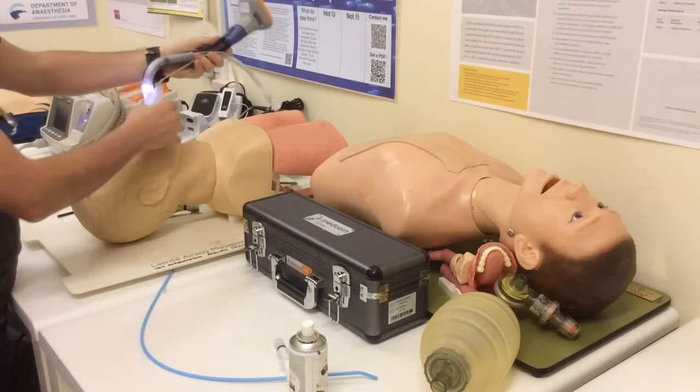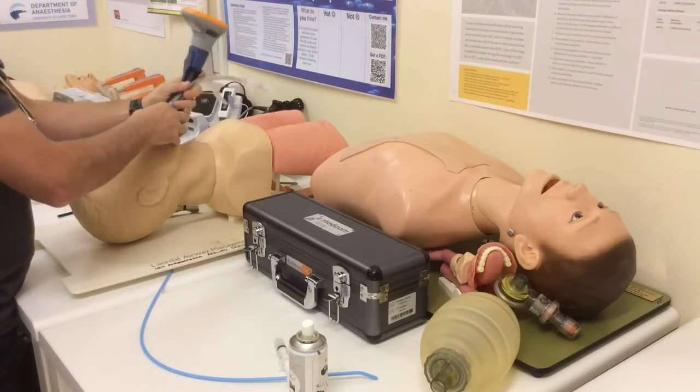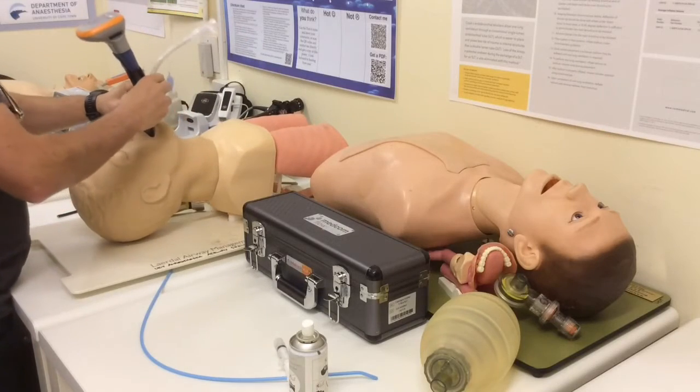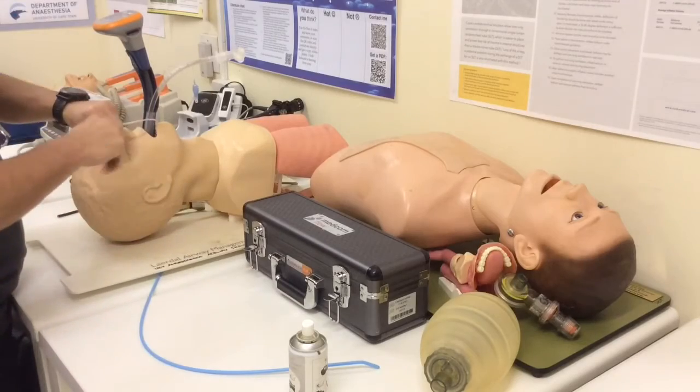Right, then I'm going to pretend I'm touching the stem to the chest. I'm going to put it into the patient's mouth. I'm going to advance it in like I would any other LMA. And when it's in, and I'm happy with how it's seated, I blow up my laryngeal mask cuff.